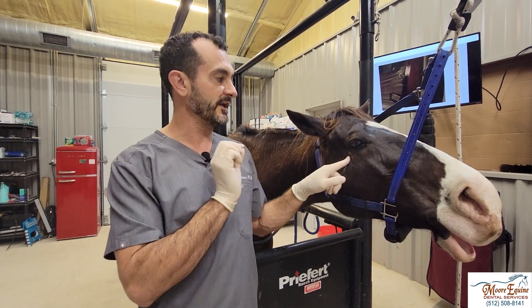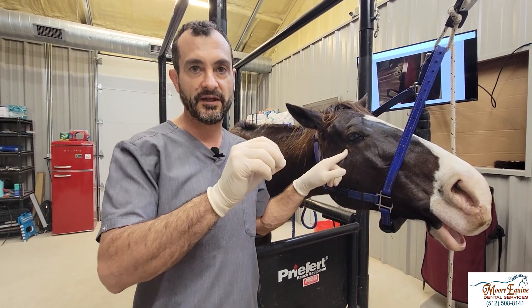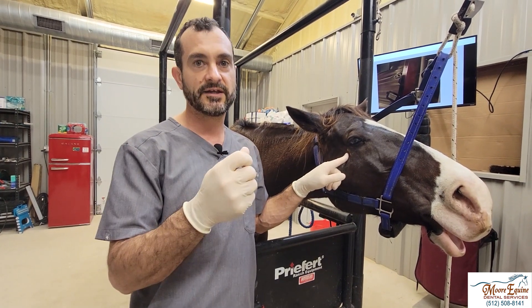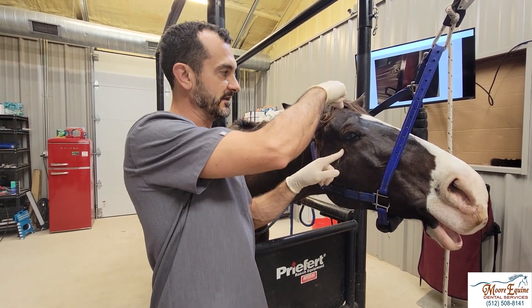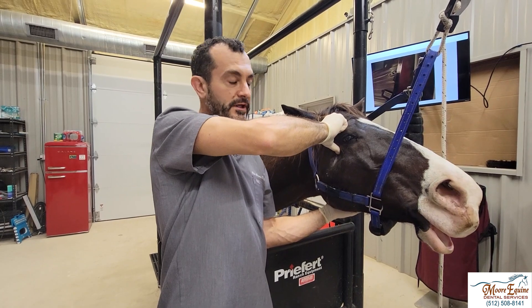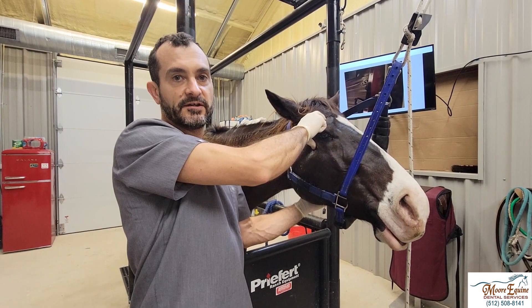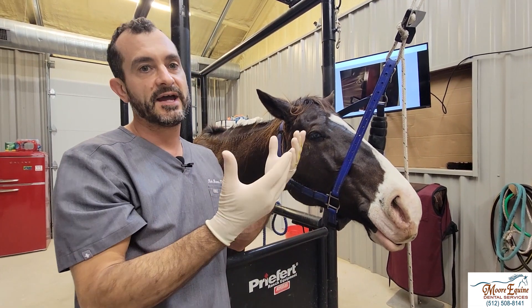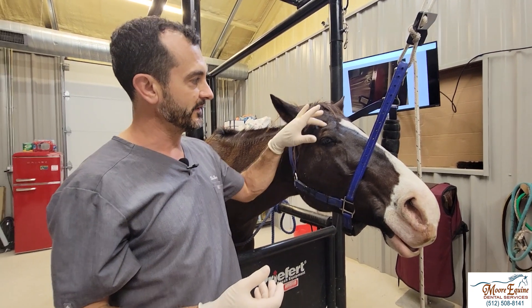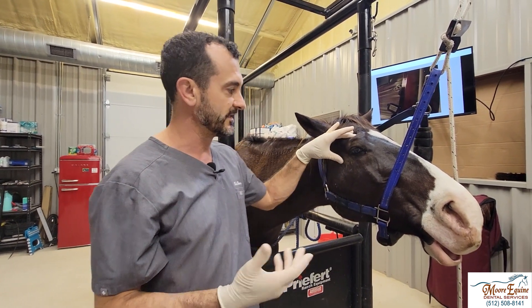I put in about eight mils right here, then I back out a little bit and put about three or four mils in here, making sure I'm not in a blood vessel — that looks great — then pull it out. You can see how that whole process only took a few seconds. If I had gotten a flashback or aspirated and felt I was in a blood vessel, don't panic — just pull out about a quarter inch, aspirate again to confirm you're out of the blood vessel, then put the lidocaine in. Raise the head and hold pressure on the extra-periorbital fat pad — really hard pressure for about five minutes — keep the head high. You may get a little swelling, but as long as you still have a divot there you won't get any protrusion of the eye.